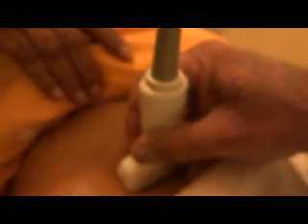My scanning angle is this. Place the probe under the subcostal region and bring it down. Give a little pressure. And here, you see, the liver is exceeding the lower pole of the right kidney.